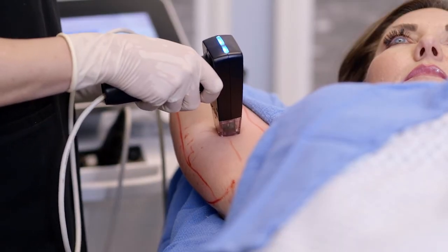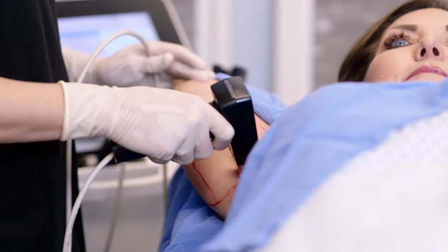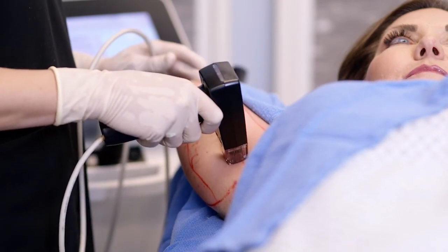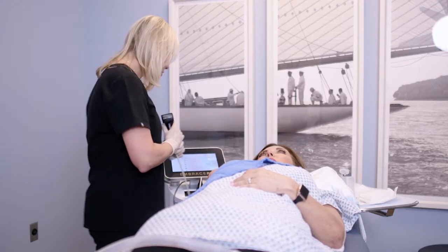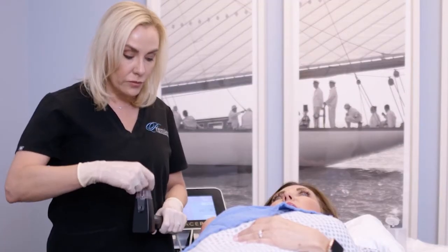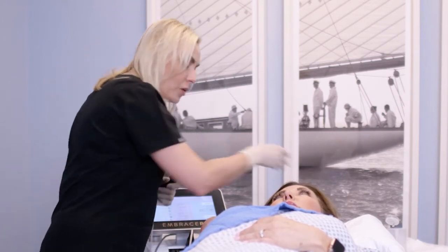So Accutite and Morpheus, when the procedures are done together, we call it Embrace. And it's basically just delivering lots of radiofrequency energy all the way through the skin to melt fat and to tighten the skin. So now we're going to actually change our settings, and we're going to go to the 3 millimeter. And then we're going to repeat the exact same process with the 3 millimeter depth. So it's just not going to go quite as deep.